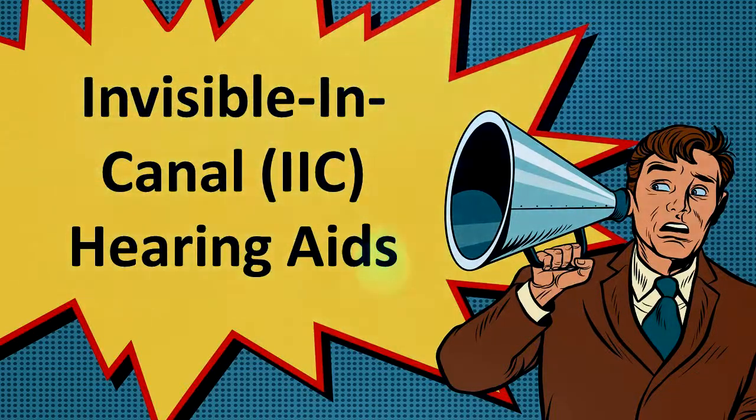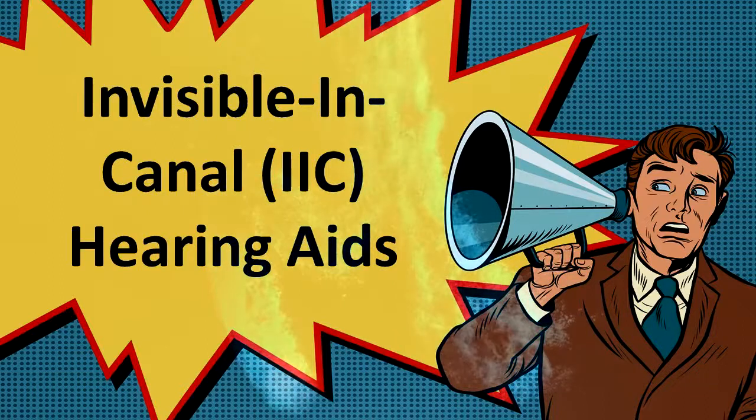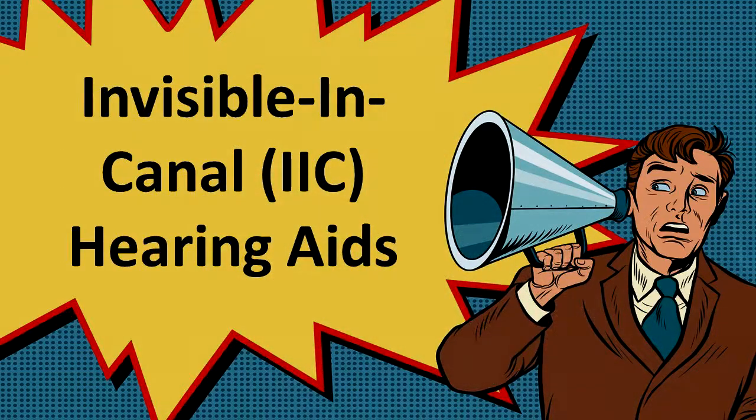Invisible hearing aid. The top choices. There are a few types of invisible hearing aid available to those who want a more discreet type of unit that allows them to hear without the stigma of wearing a hearing device. Hearing aids that are deemed invisible are units that are worn inside the ear. These types of units require the services of an audiologist or a doctor to fit it, because it has to fit based on the severity of your hearing loss, the size of the unit, and the shape of your ear.